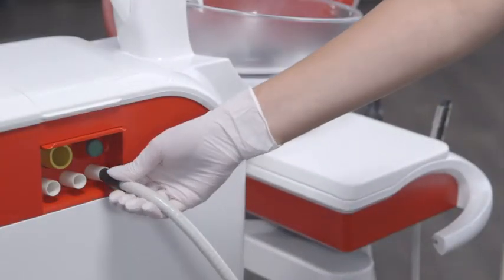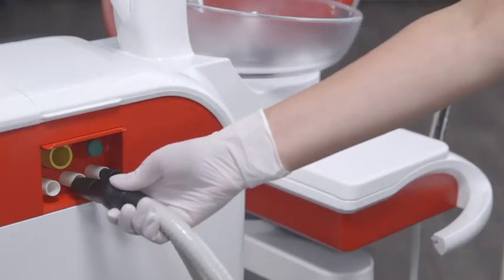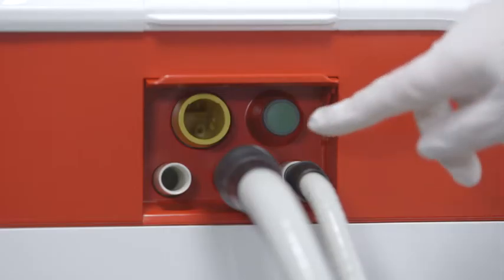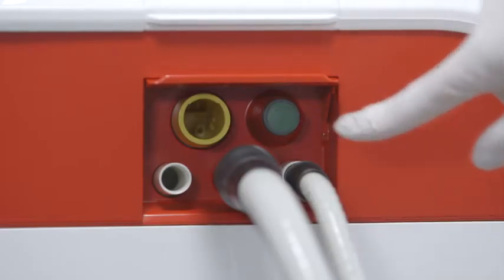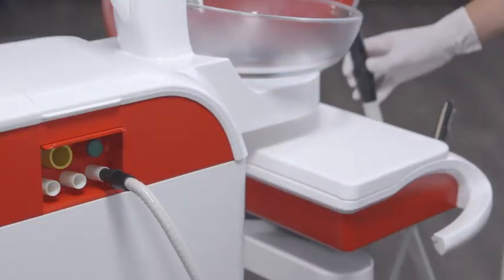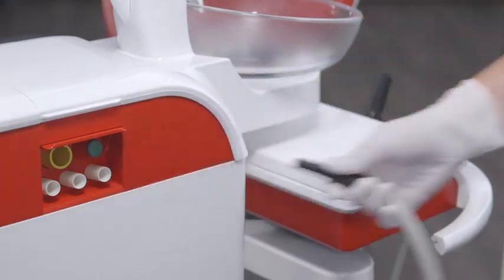Perform suction hose cleaning after every patient. Place the suction hoses in the adapters in the water unit and press the green button to start the function. Remove the suction hoses from the adapters and return these to their original position when suction hose cleaning is completed.